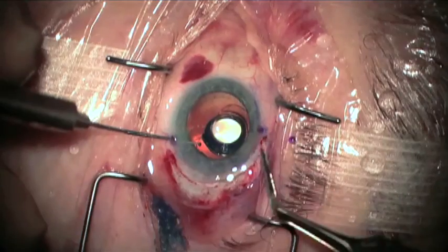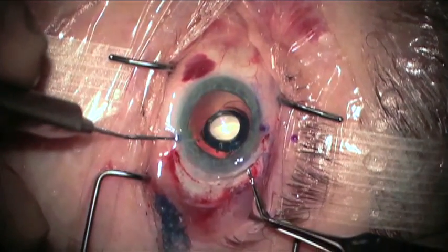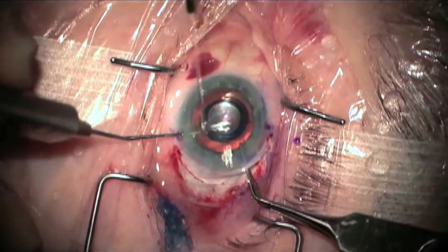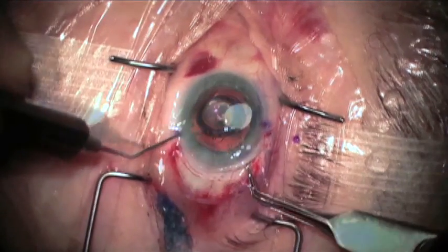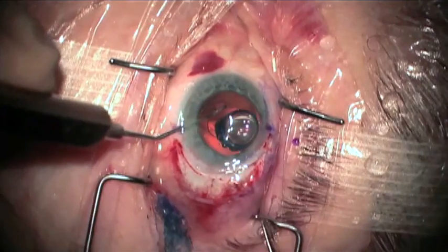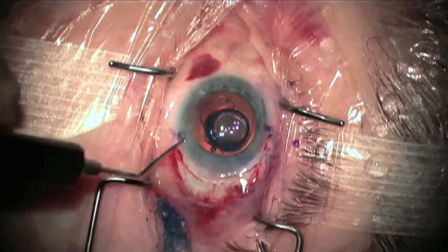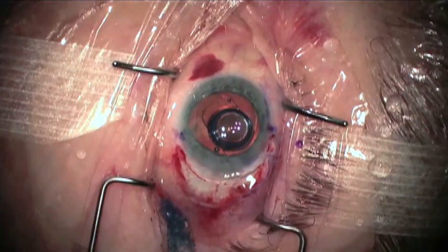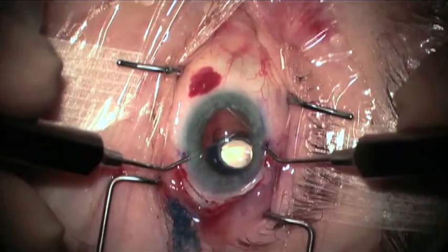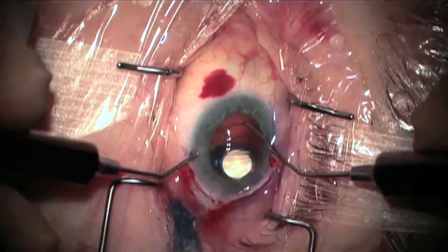In this situation, a Szynski hook is used in the fixation hole on the plate carrier, and the loop is compressed. If this fails to capture the loop in the capsule bag, it will be necessary to compress the loop with a second instrument. It is very difficult to dial these loops into the capsule bag, given their rigidity and their size of 13.5 millimeters.